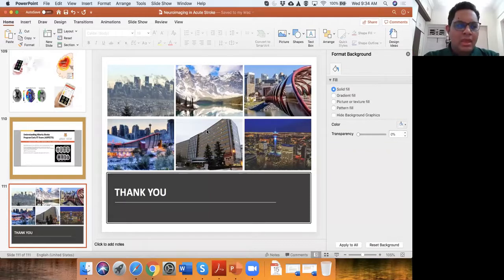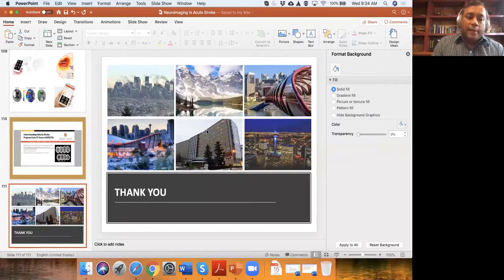Okay. How does clot size, clot burden decide treatment management? Yeah, so with endovascular thrombectomy, if you see a large vessel occlusion, such as an ICA occlusion, M1 occlusion, proximal M2 occlusion, basilar occlusion, you should treat, right? So the location is important. You clearly know that on a CT angiogram. But the extent of thrombus is also important.